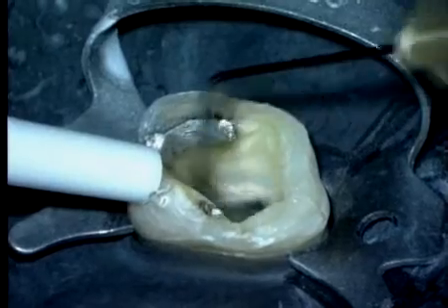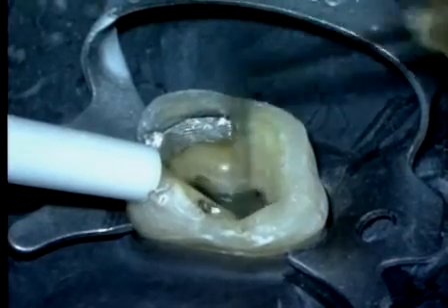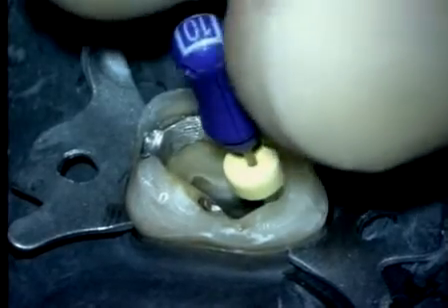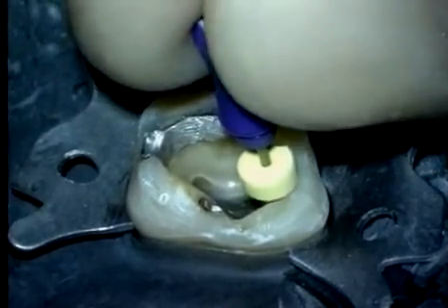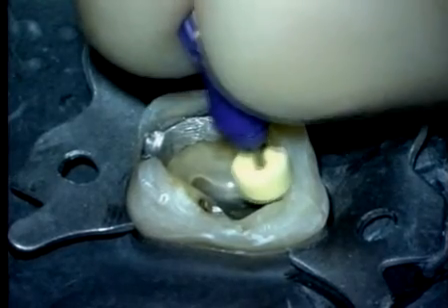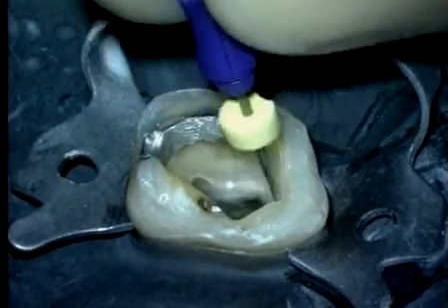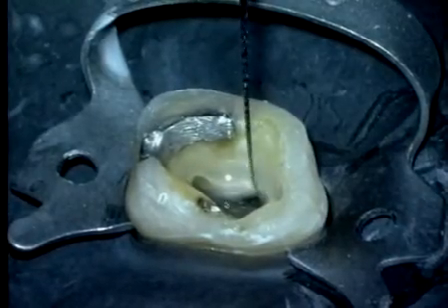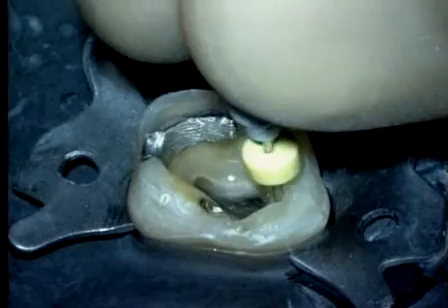Again, we'll irrigate and recapitulate and re-irrigate. The 10 file is gently placed to length. Patency is again maintained. Little short amplitude strokes assure the glide path and pave the way for the 15. At this stage of treatment, the 15 file will readily drop to length.